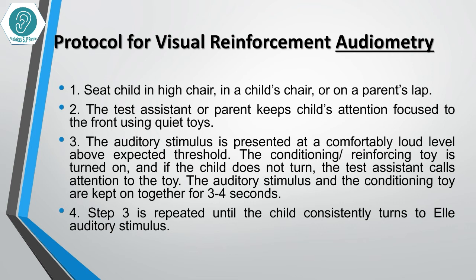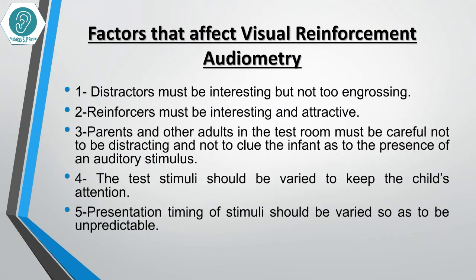The conditioning reinforcing toy is turned on. If the child does not turn, the test assistant calls attention to the toy. The auditory stimulus and the conditioning toy are kept on together for three to four seconds. Step three is repeated until the child consistently turns to the auditory stimulus.